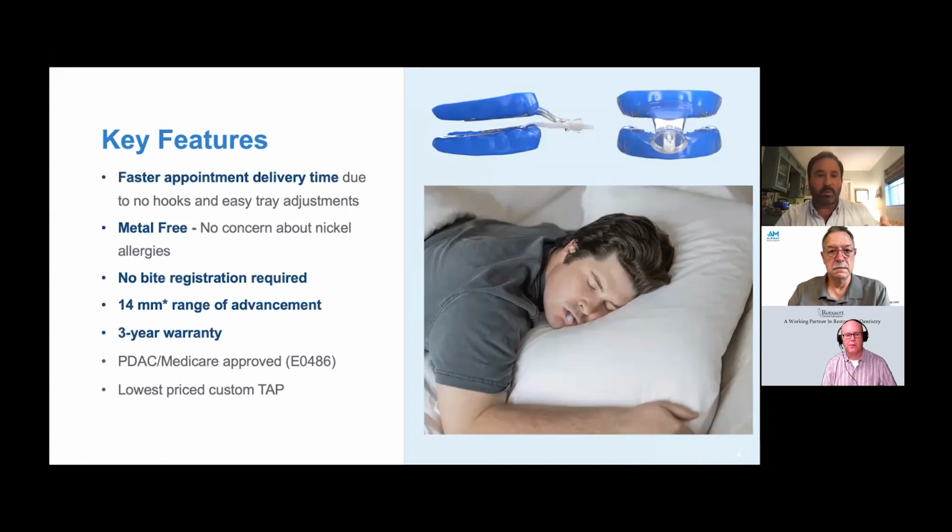But that's a very big part of oral appliance adoption, let's be honest: the patient has to get used to wearing a mouthpiece to begin with. And then we always advise, unless they're real severe or something, that you gradually titrate to that sweet spot. The sweet spot is the best benefit, meaning efficacy or treatment wise, with the least stress on the jaw joints, as well as where it's comfortable, where they're going to wear it night after night. So all those kinds of things wrapped into one.